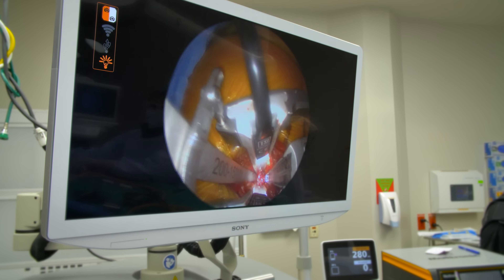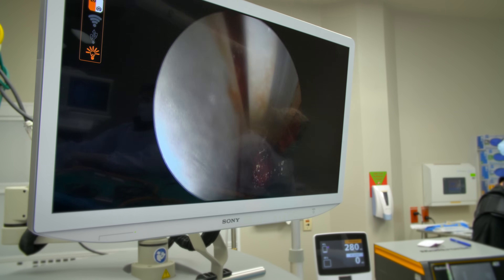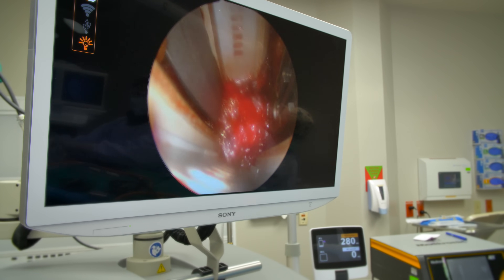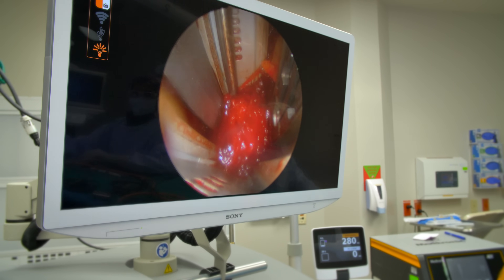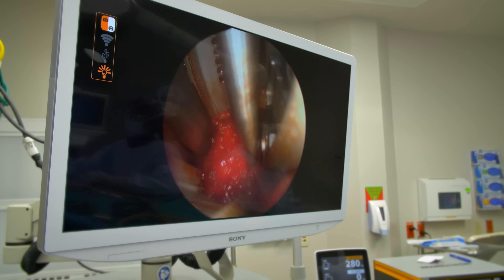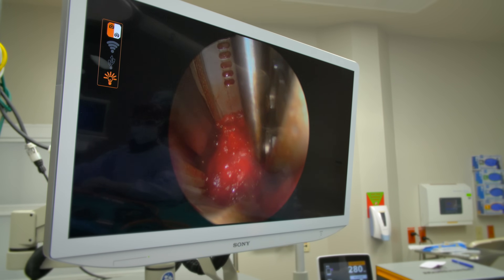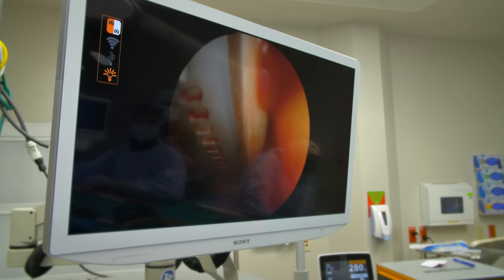This is our retractor. We went through the psoas muscle — we're retroperitoneal — and this is the disc space right there. The residual psoas muscle is visible here, and we're going to remove all that disc. This is where our cage is going to go.